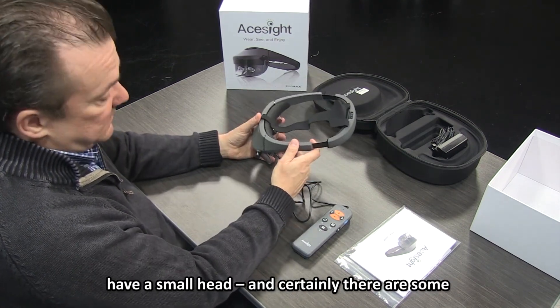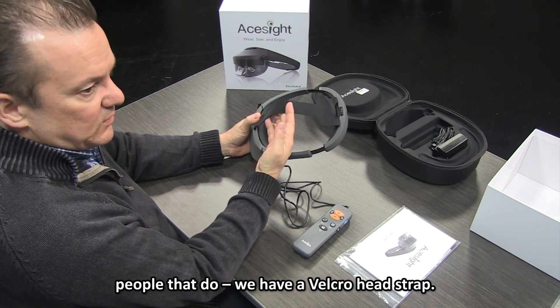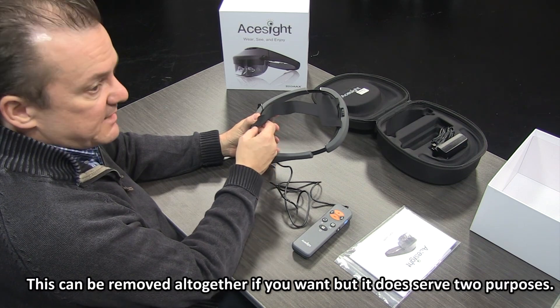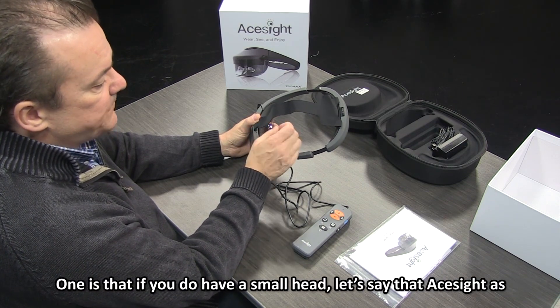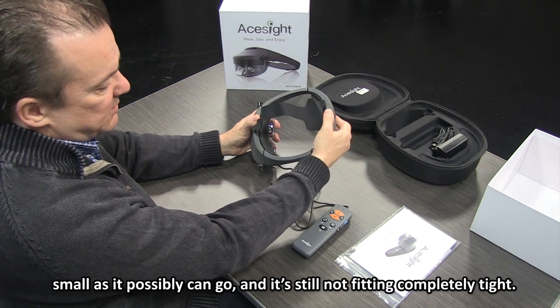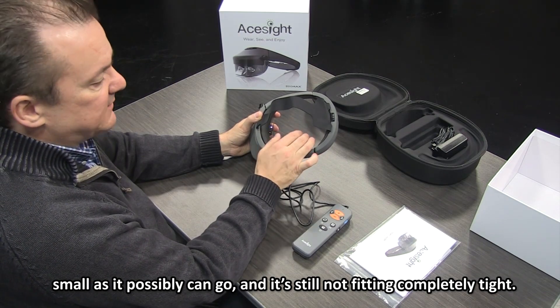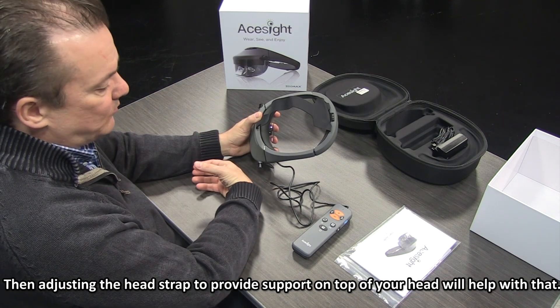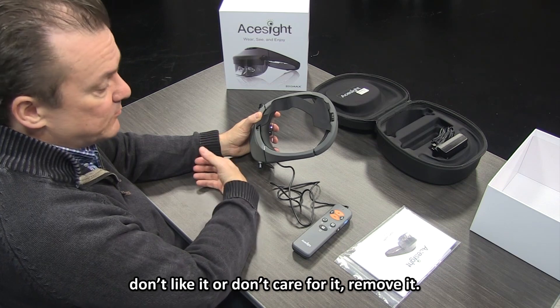If you happen to have a small head, we also have a Velcroed head strap. This can be removed altogether if you want, but it serves two purposes. If ACE Sight is as small as it can go and still not fitting completely tightly, adjusting the head strap to provide support on top of your head will help. But if it gets in the way or you just don't like it, remove it.